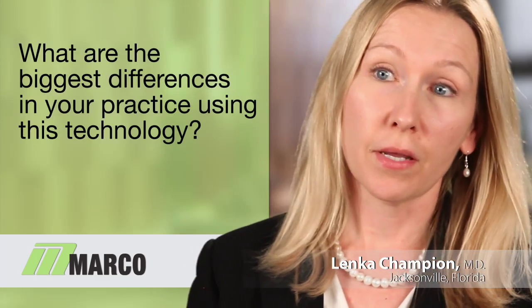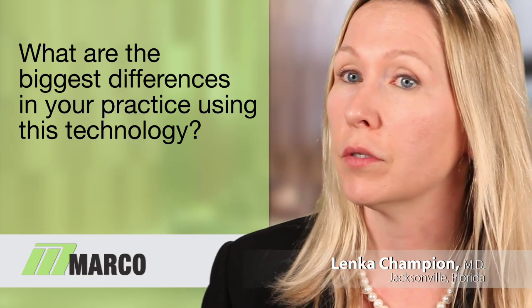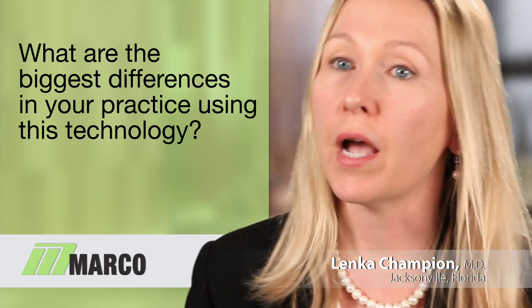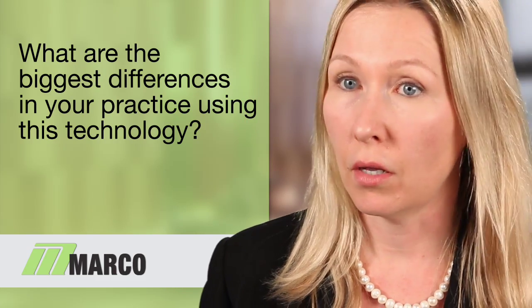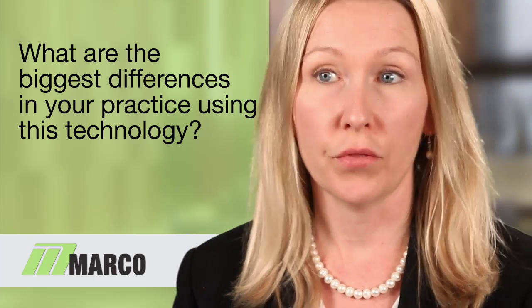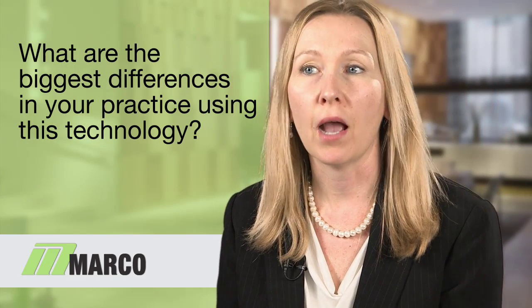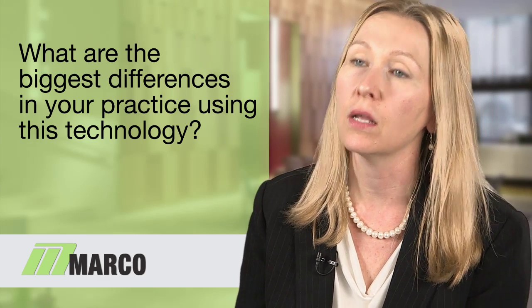Well, prior to OPD, in our toric patients, in their postoperative day 7, we used to dilate these patients and check the alignment of the toric IOL with the dilation. Sometimes it was not easily done because these patients sometimes don't dilate very well, and then they had to sit there for 45 minutes to get their pupils dilated.